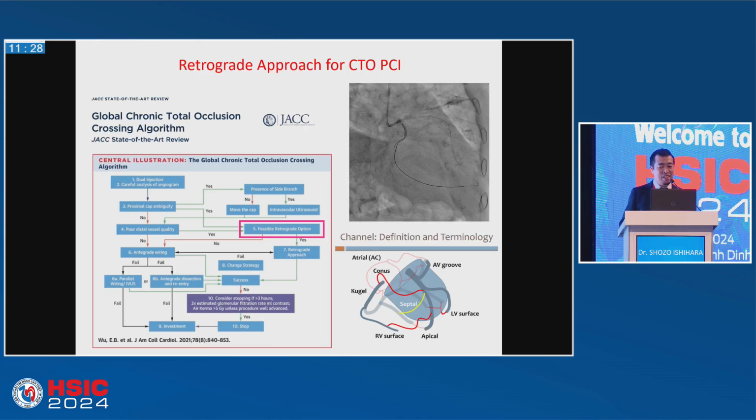Yes. So, as you know, when we do CTO PCI, we sometimes consider the retrograde approach. This is a global algorithm of CTO.